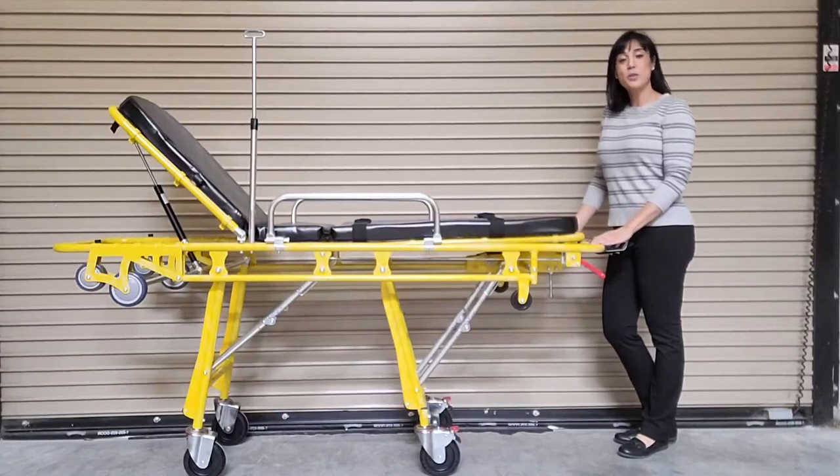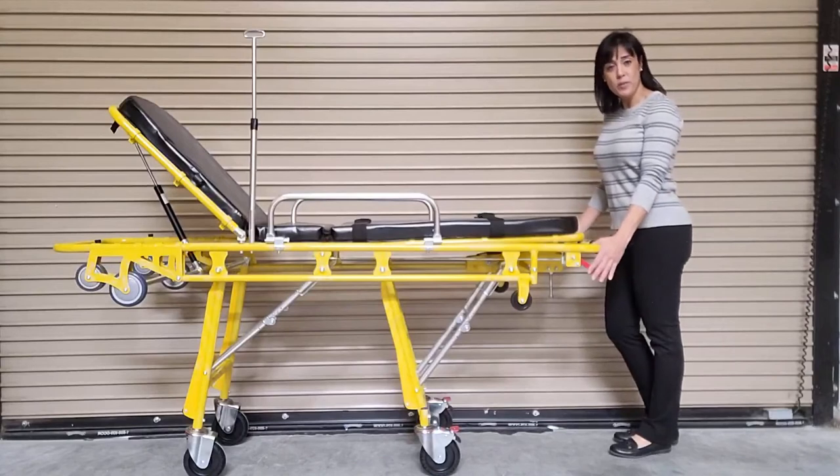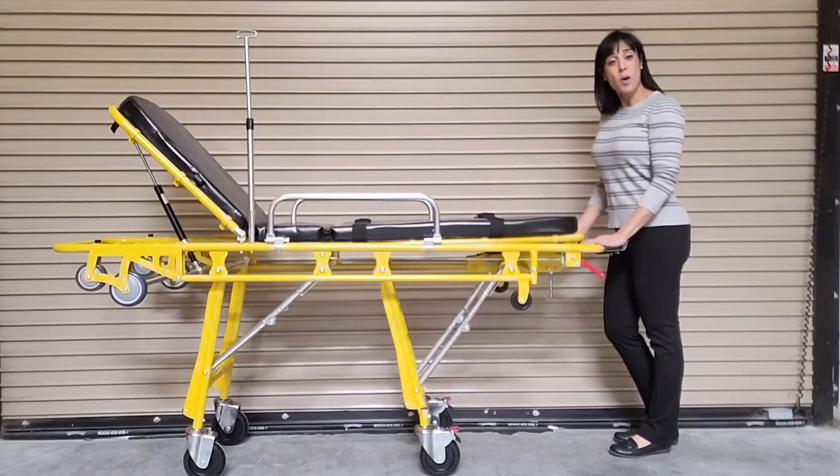This unit can be loaded into a transportation vehicle with only one operator. To do so, the operator would simply squeeze both of the red handles located at the foot end of the stretcher and push it up against the bumper of the transportation vehicle. The legs will automatically collapse underneath the stretcher.